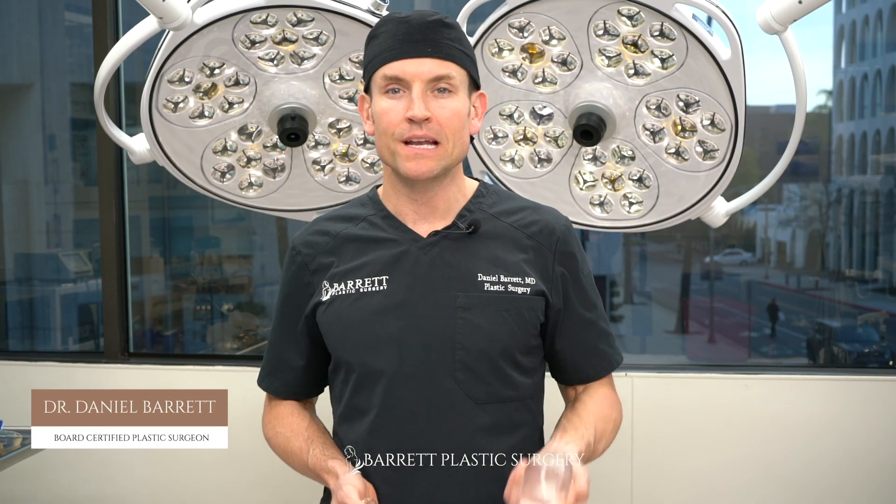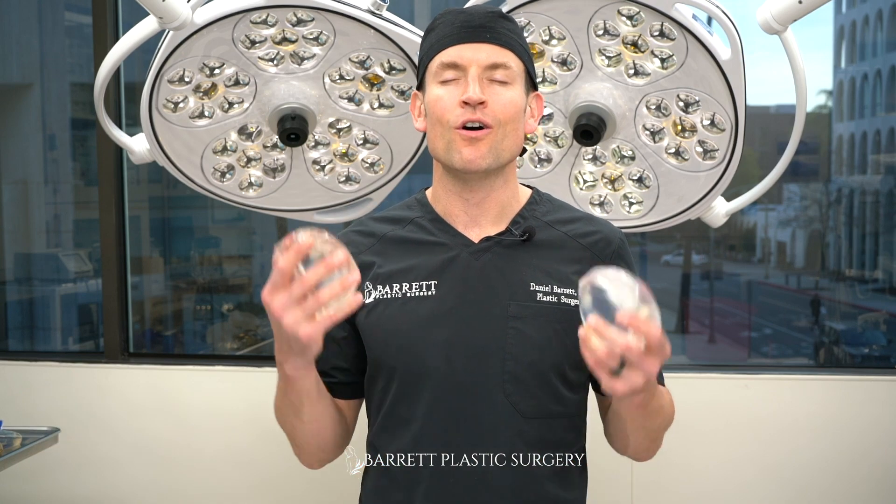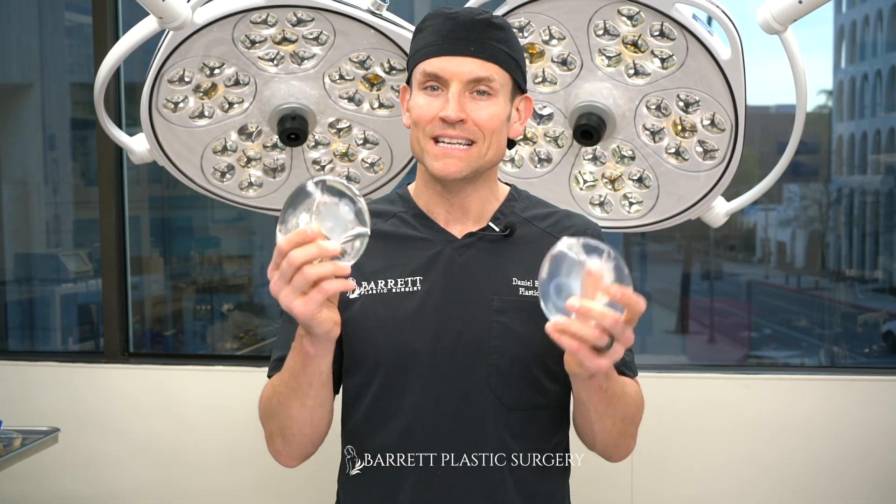Hey everyone, I'm Dr. Daniel Barrett and I'm a plastic surgeon. I get asked all the time about the durability of implants, whether it's silicone or saline. So we're about to find out how durable these implants actually are.